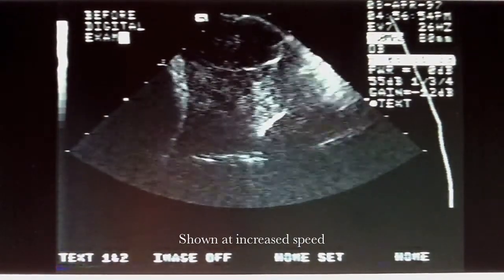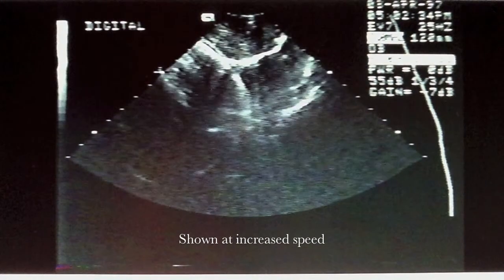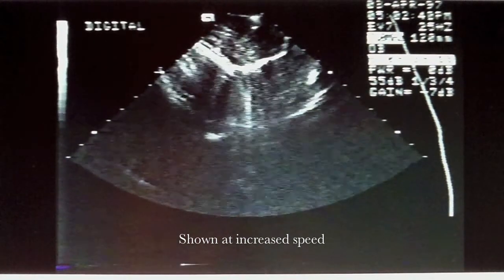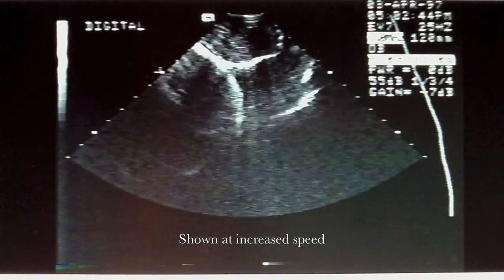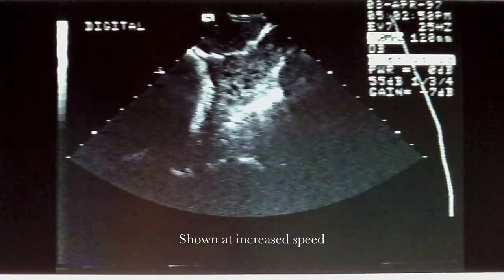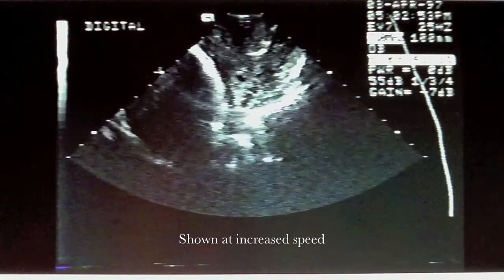Then an examination was done with the ultrasound turned off, and you'll see a much thicker, much brighter stripe of ultrasound contrast media after the examination. The contrast media, or things that could have been in the vagina, like group B strep or other microorganisms, is readily transported up into the lower uterine segment and even onto the bag of waters. You'll see that quite dramatically with the baby's head and then the bright cap of the ultrasound contrast media within the uterus. After this, the subject did not go into labor or suffer any complications.